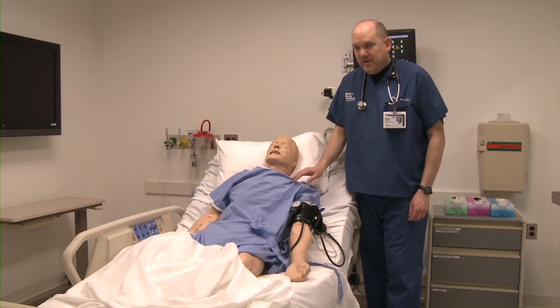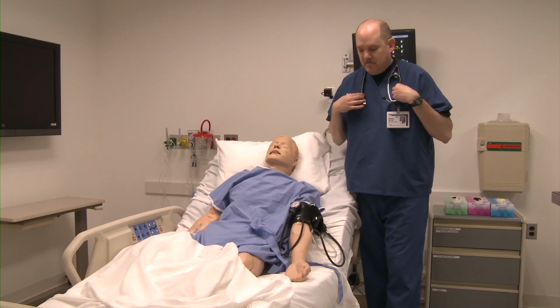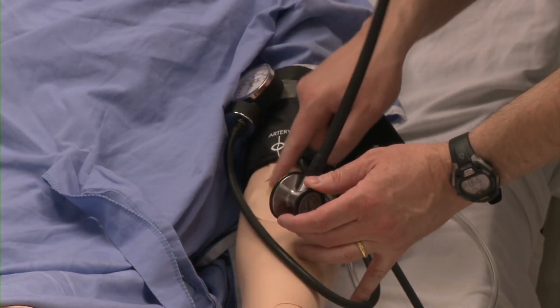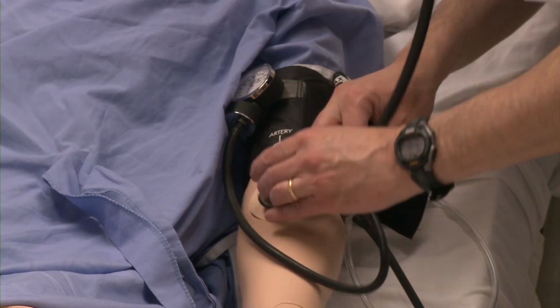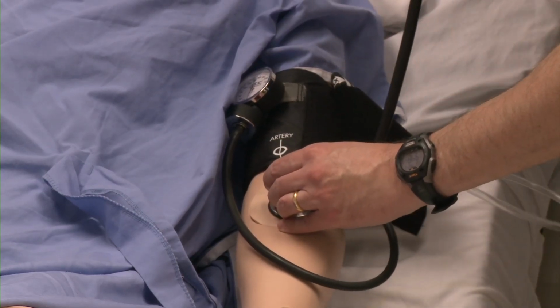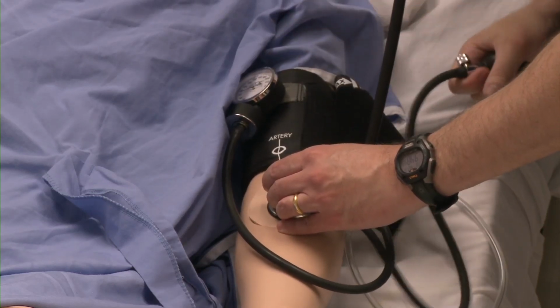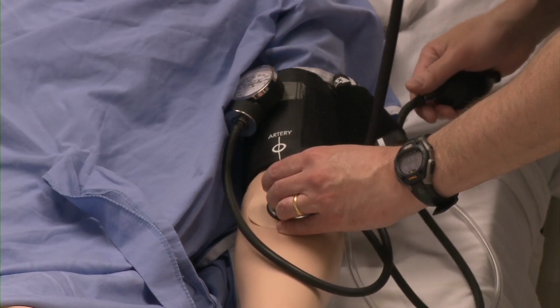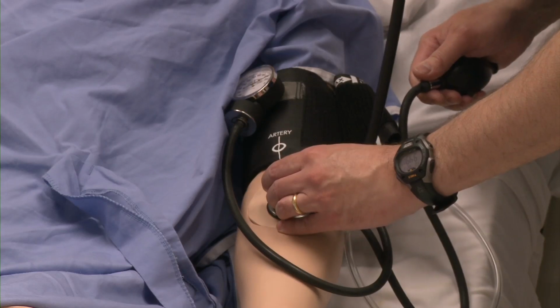Blood pressure can be assessed using the attached sphygmomanometer and your stethoscope. Place the diaphragm of your stethoscope in the center of the circular soft patch in SimMan's antecubital fossa. Inflate the cuff as you normally would, watching the gauge as you inflate. When you've reached the level that you want, slowly and gently release the air while watching the gauge.